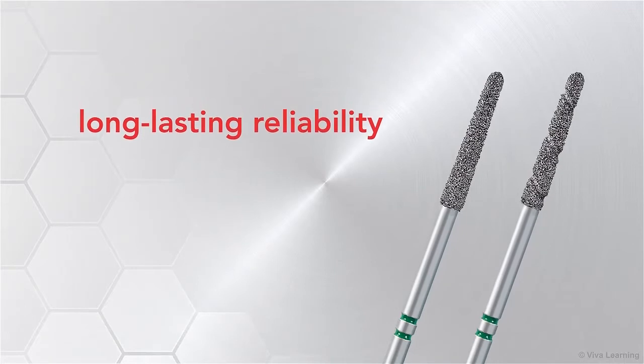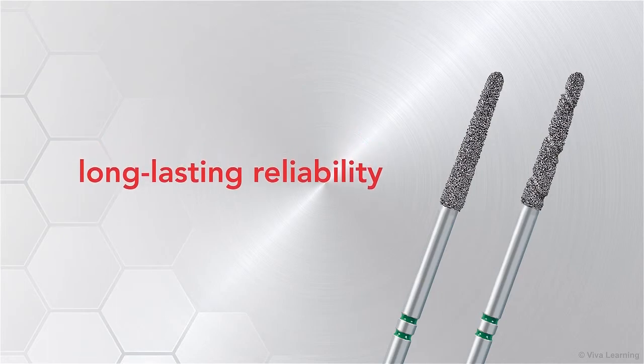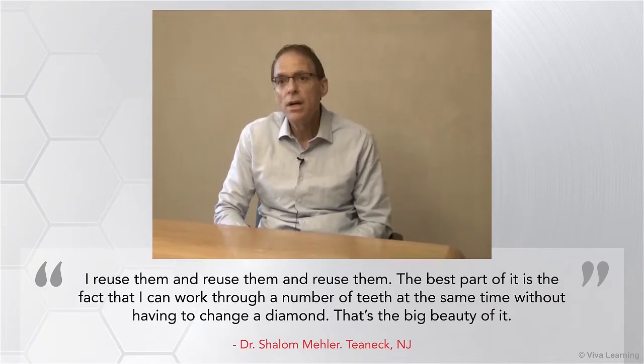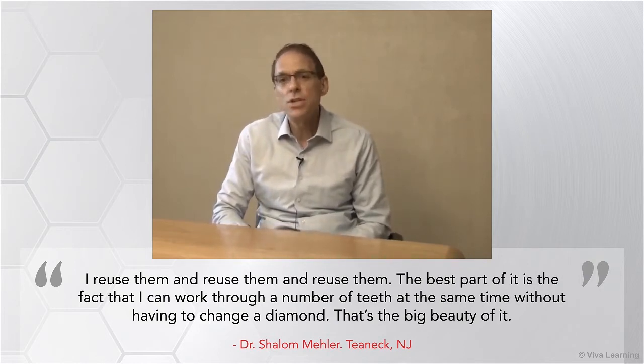Over time, as you continue to use your Two-Striper Ultra Premium Diamond Burrs, you'll really appreciate their long-lasting reliability. I reuse them and reuse them and reuse them. The best part is that I can work through a number of teeth at the same time without having to change a diamond. That's a big beauty of it.